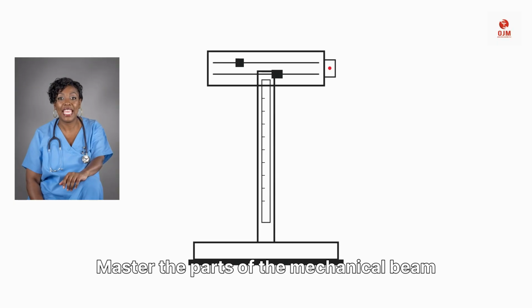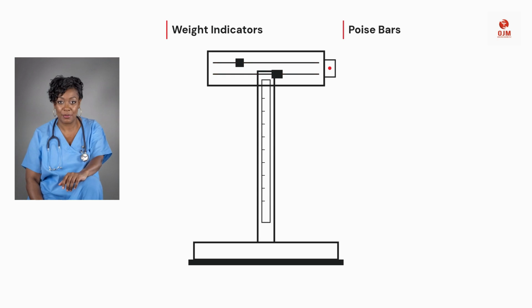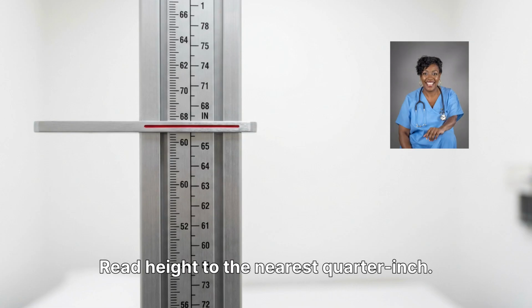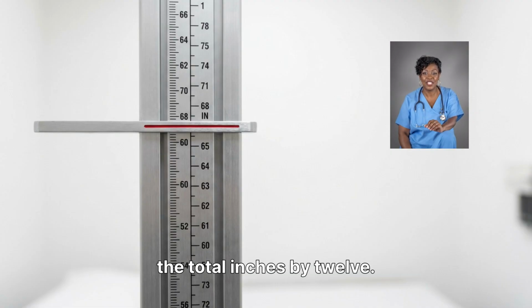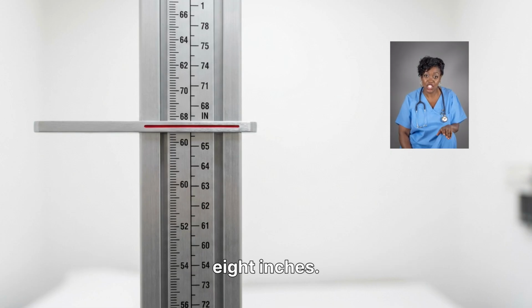Master the parts of the mechanical beam scale. This includes the upper and lower poise bars, weight indicators, and the height rod with upper and lower sections. Read height to the nearest 1/4 inch. To convert to feet and inches, divide the total inches by 12. For example, 68 inches is 5 feet 8 inches.